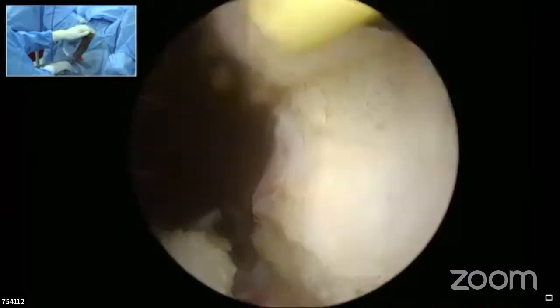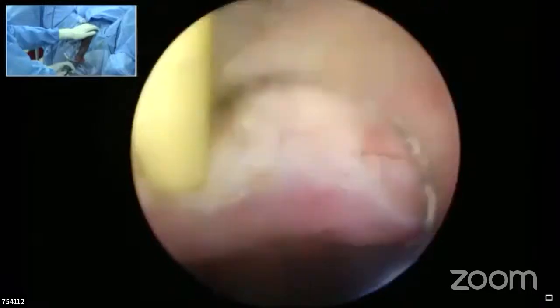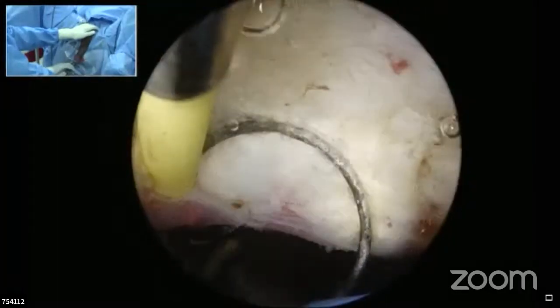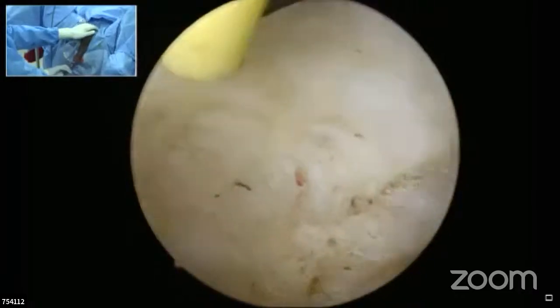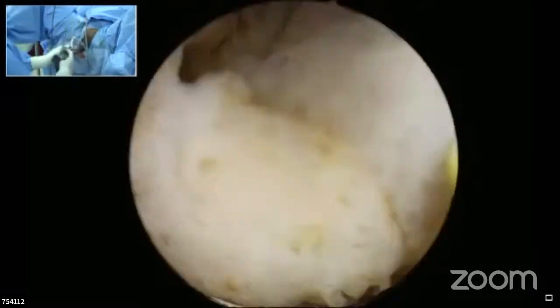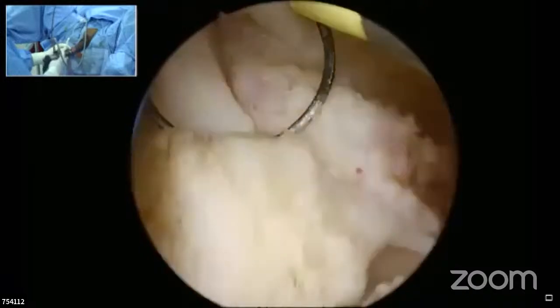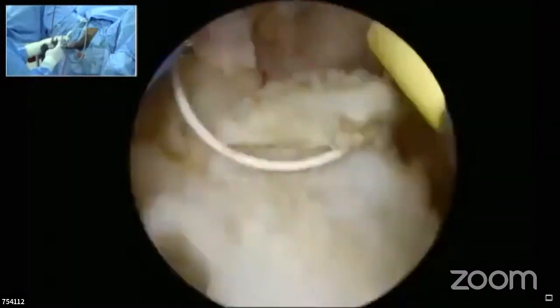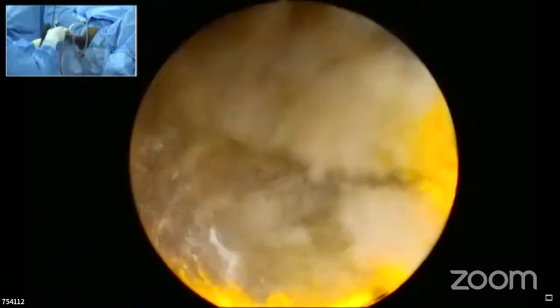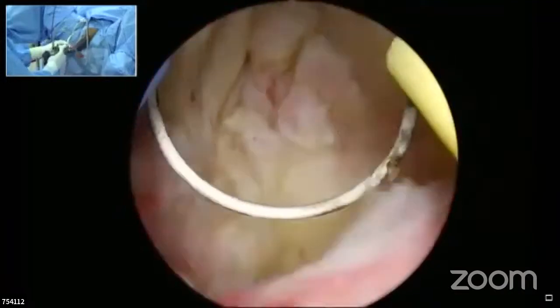The best bipolar energy is what was actually devised by Gyrus initially, which was taken over by Olympus later. The best bipolar was the PK, the Gyrus orange box, it's called. That was bought over by Olympus and incorporated into their diathermies, which shows promise and is good. The cutting is much better with the Olympus modified version, but the coagulation was the best with that orange box.